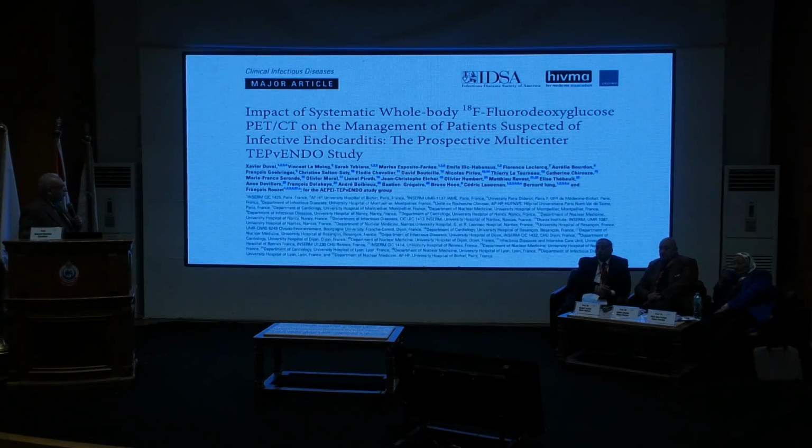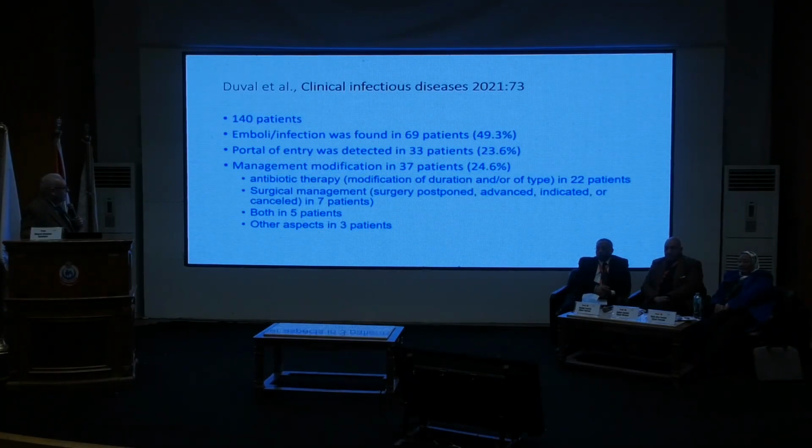This is a multi-center trial to see the impact of FDG PET-CT on the management of patients with suspected infective endocarditis. They found emboli infection in almost half the patients, and management was modified in almost 1/4 of the patients after FDG PET-CT.